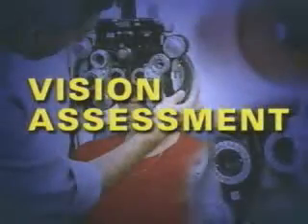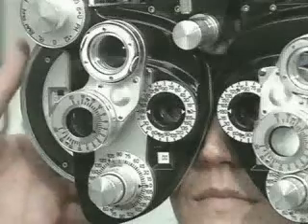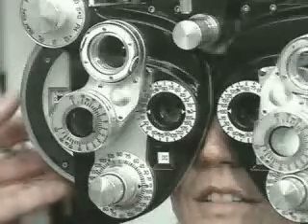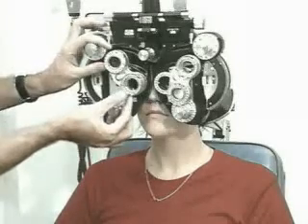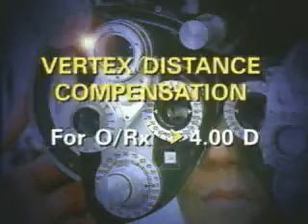Visual assessment. After determining the best-fitting Rose K trial lens, a spherical over-refraction is performed to evaluate visual performance. Begin by using plus and minus 1 diopter steps and then fine-tune in half or quarter diopter steps. If unsatisfactory vision is obtained with a spherical lens, then perform a spherocylindrical assessment. The power of the best trial lens plus the over-refraction is recorded as the final lens prescription.